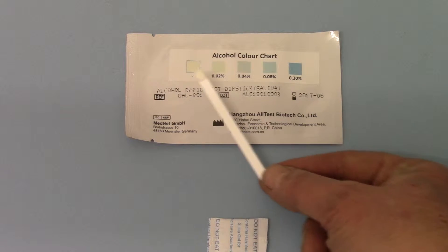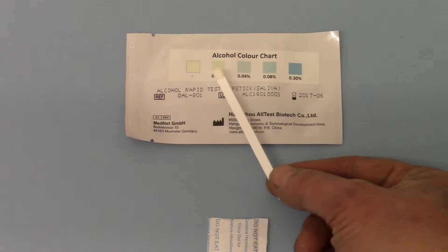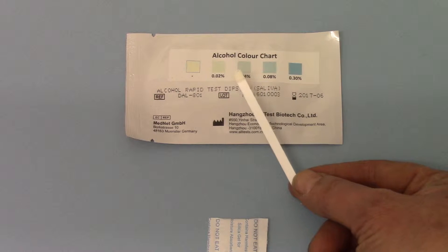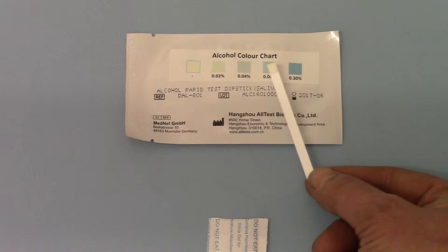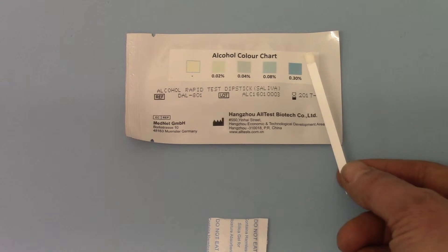If alcohol were present at 0.02% BAC — that's 20 milligrams per 100 mls of blood alcohol concentration — you'd see a very pale discoloration. At 0.04% it would be slightly darker, at 0.08% you would have this match here, and at 0.30% — which is extremely high, 300 milligrams per 100 ml — it would go this dark blue color.